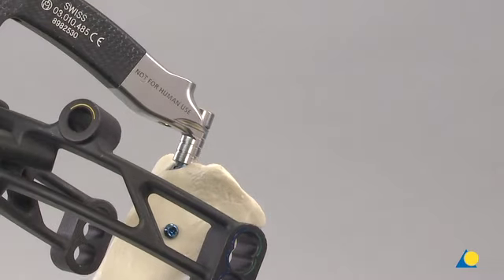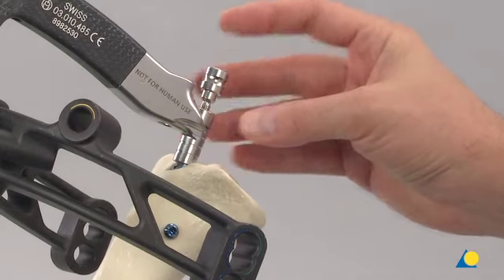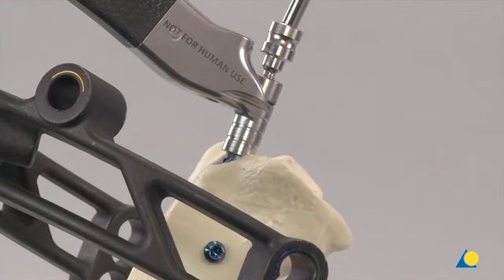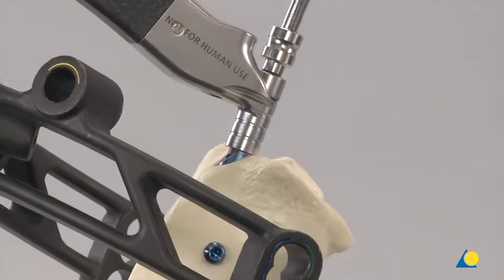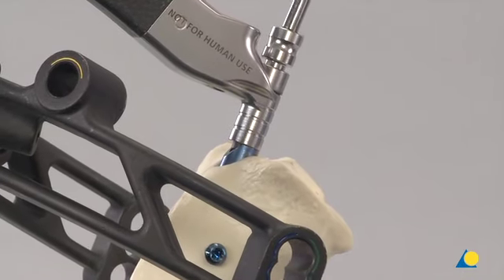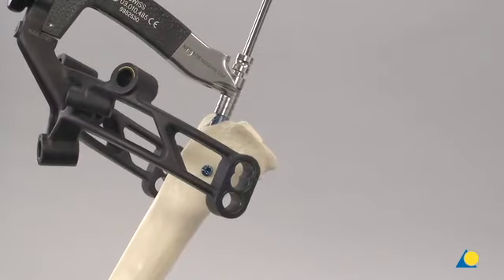The compression screw is then inserted through the connecting screw and into the nail using the screwdriver hexagonal 8.0 mm diameter with spherical head and T-handle. As it is advanced, the compression screw will contact the dynamic locking screw, causing a reduction in the fracture gap. Each revolution of the screw corresponds to a compression of 1 mm, up to a maximum of 7 mm. Care is taken not to over-tighten the compression screw. After the required compression has been achieved, the compression screw is removed with counterclockwise turns.